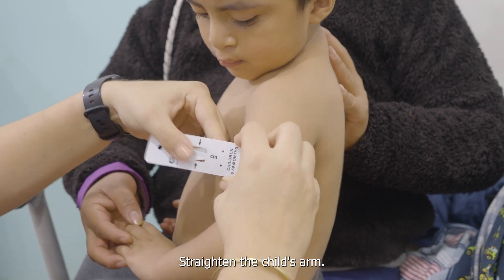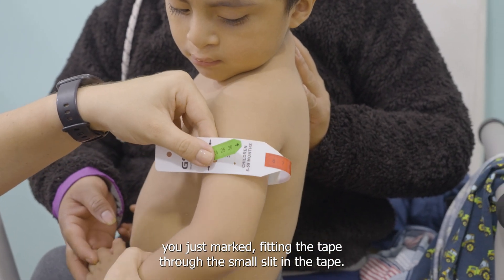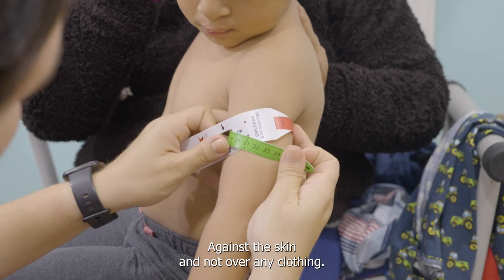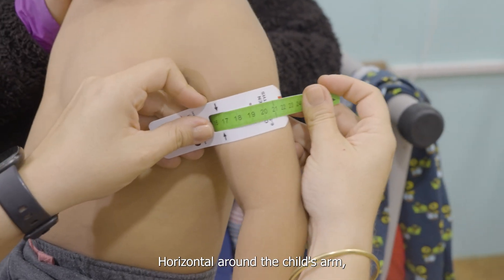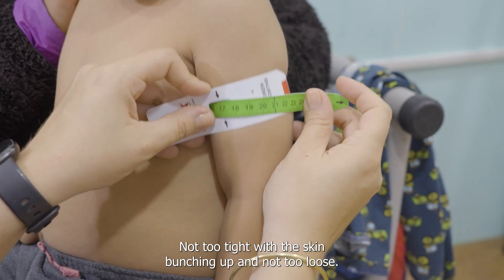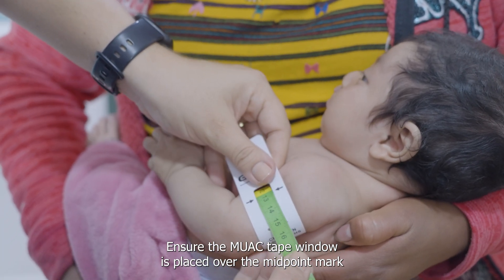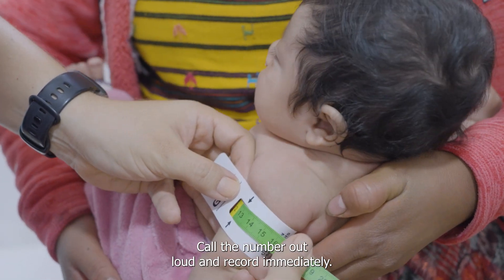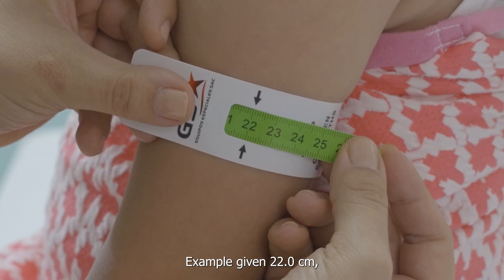Straighten the child's arm. Wrap the tape around the child's arm to the midpoint you just marked, fitting the tape through the small slit in the tape. Ensure the MUAC tape window is placed over the midpoint mark and read the measurement to the nearest millimeter in the viewing window. Call the number out loud and record immediately. For example: 22 centimeters.